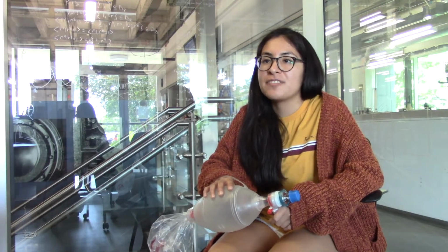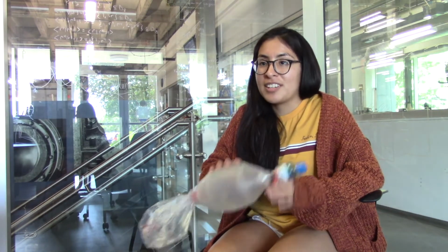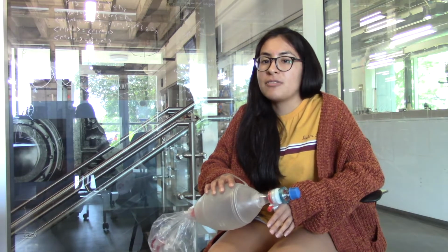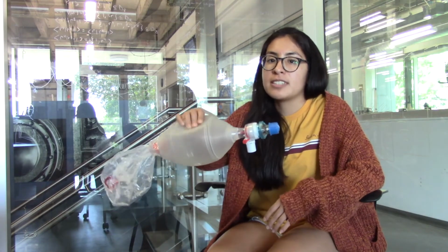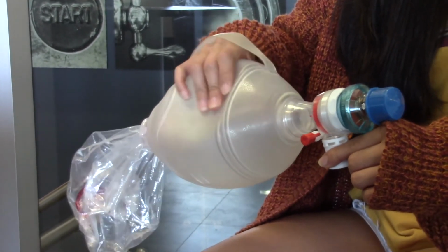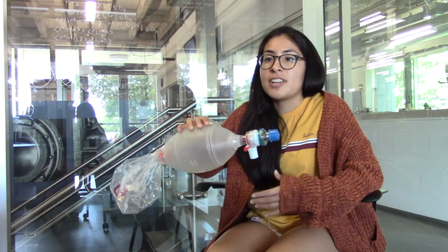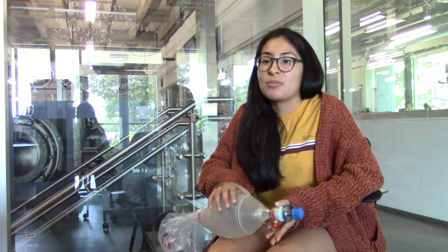Our team was tasked with creating a low-cost, long-term ventilation device for low-resource settings. In the US, there are ventilators that treat respiratory distress. However, in low-resource settings, these high-end ventilators are not accessible. Therefore, medical personnel are forced to use a device called the bag valve mask to manually ventilate a patient. However, due to the lack of medical personnel, family members end up having to ventilate loved ones for hours on end. This is very inaccurate and tiring. Therefore, there is a need for an automated solution, and that is where we come in.